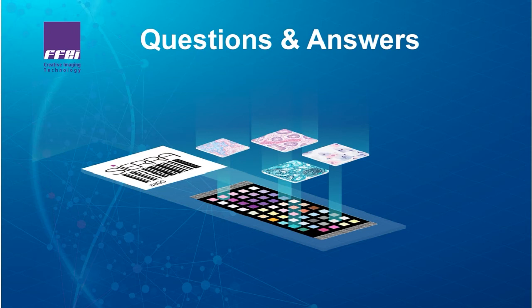But also users may choose to compare individual groups of scanners, 3, 4, let's say, over time to establish any change or drift, as we refer to it, in the colour of those machines over time, or in fact have one or two regular machines that they want to implement a routine procedure on, so that on a frequent period of time they use the slide to keep that calibrated. So the top level answer is 100 machines, but the functionality of the slide on all those machines is entirely user dependent. Thank you.